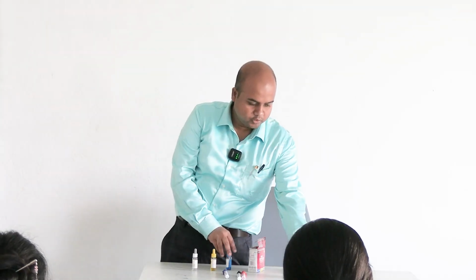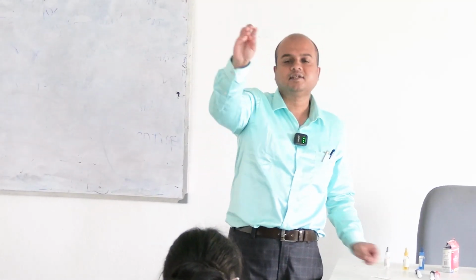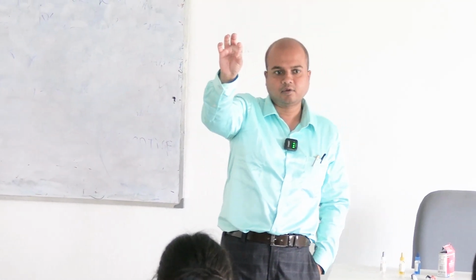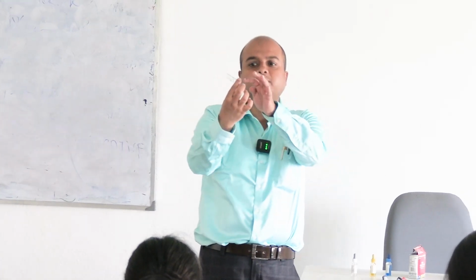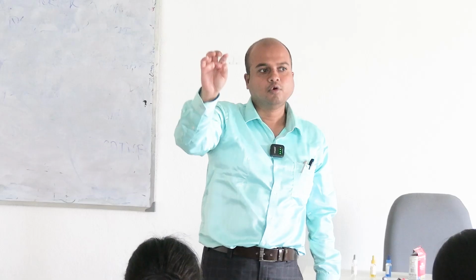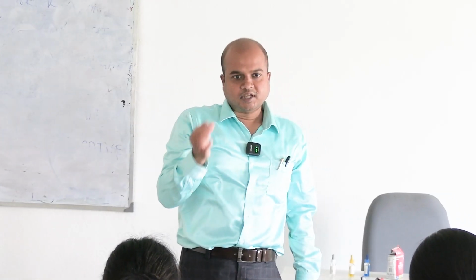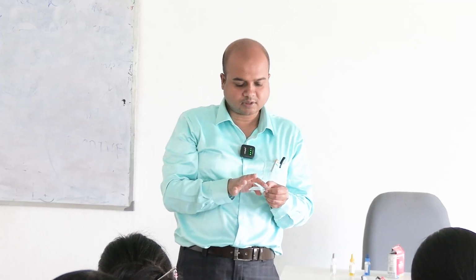For that, various authors write just simple differences. We do it like this. We take a slide and divide it into 3 parts and label it as A, B and D. We see whether an agglutination reaction is occurring in these areas, and I will explain that.